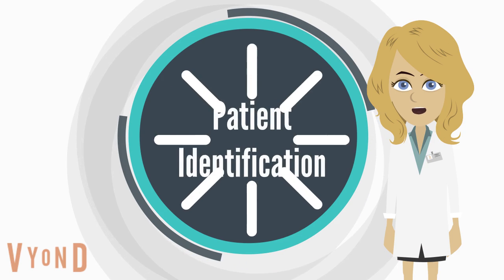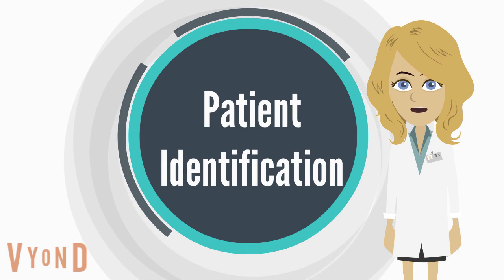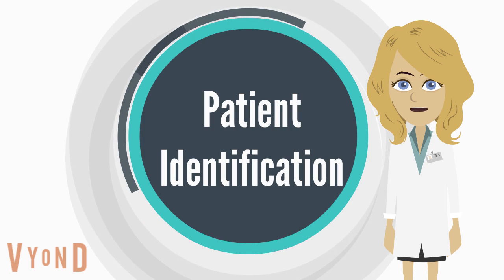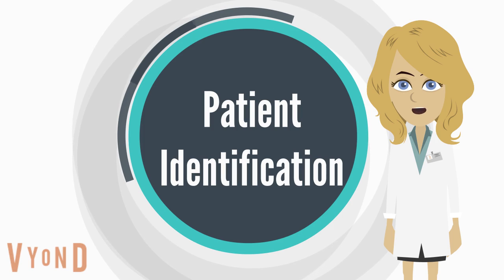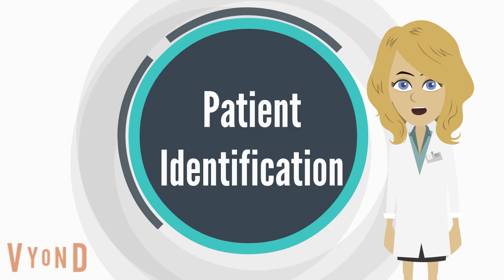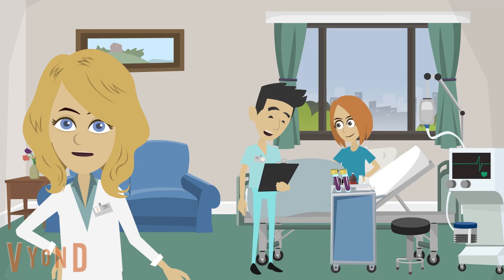Accurate patient identification is the key step to prevent this pre-analytical error for a cross-match. It can be argued that patient identification through all stages is the most important part of a blood sample collection. To correctly identify the patient before the collection, the phlebotomist should have verbally checked and confirmed the patient's identity, if they are conscious and lucid.